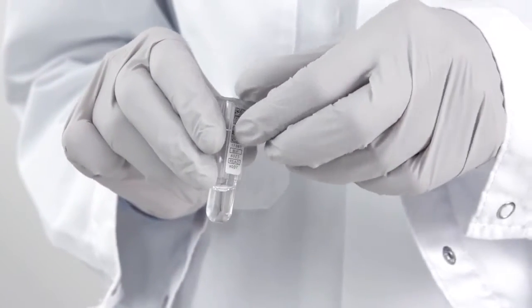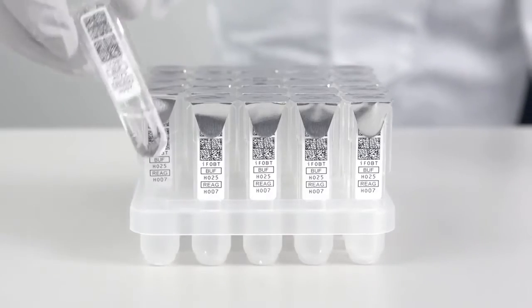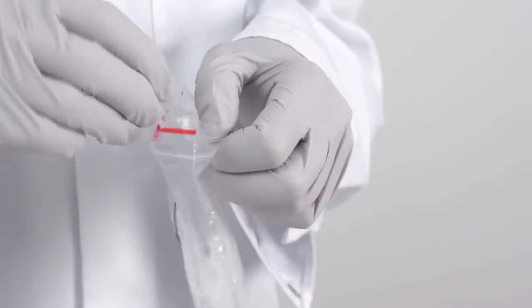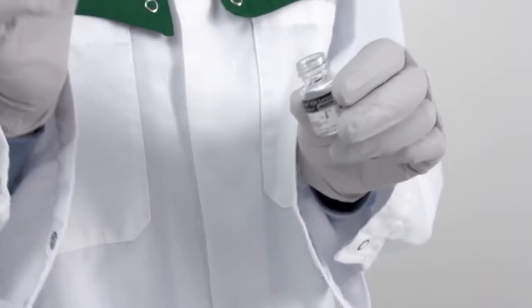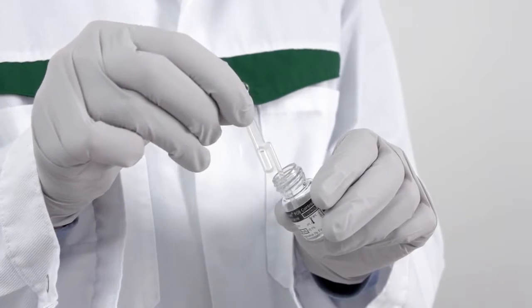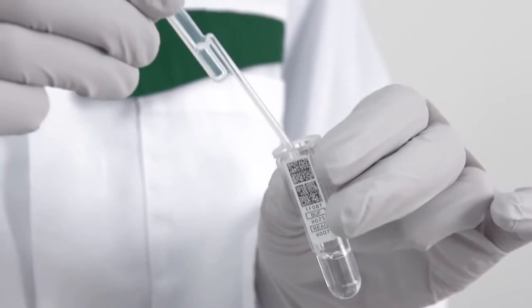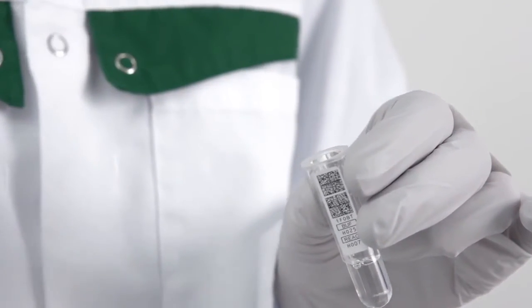Take one cuvette, holding it from the sides, and tear the foil cover off. Put the cuvette back into the cuvette rack. Open the control vial. Take one pastette and hold it by the upper bulb. Squeeze the bulb firmly and insert the tip into the control liquid. Release the bulb and lift the pastette. Make sure that the liquid has filled the whole tip. Release the liquid into the test cuvette by squeezing the upper bulb firmly.